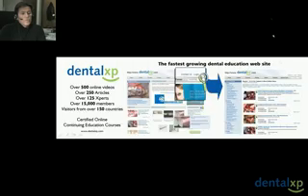So some of the questions have been asked from Bern, Switzerland. Do you prep the abutments prior to surgery, and how do you calculate how much needs to be reduced? The answer to that question for us is that we prefer to use pre-contoured abutments. We really don't like to prepare the abutments in the mouth at all.